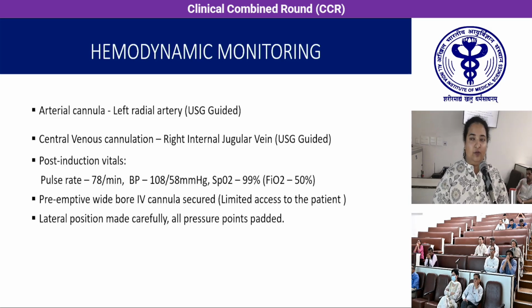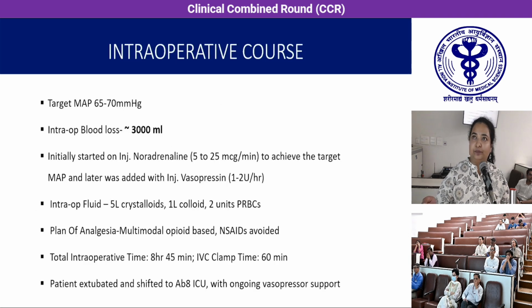Another concern was the position of the patient after the docking. We had very limited access to the patient, for which we had preemptively secured all the lines. The position was made very carefully, and in the lateral position, all the pressure points were padded. And more emphasis was given to the lower limb, as the patient was a case of poliomyelitis.